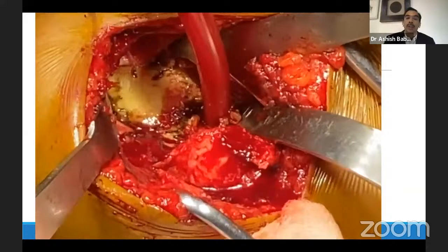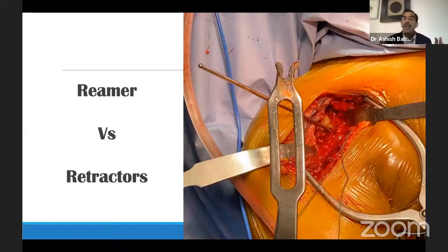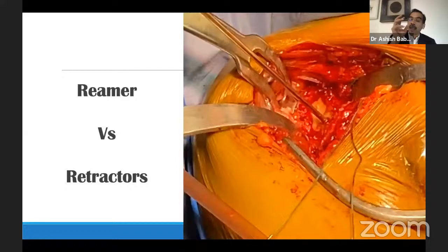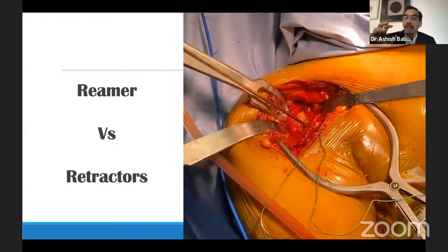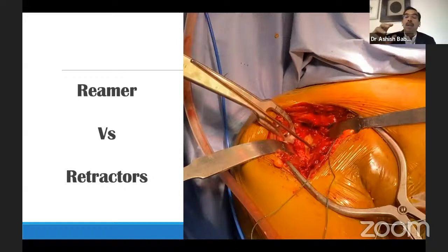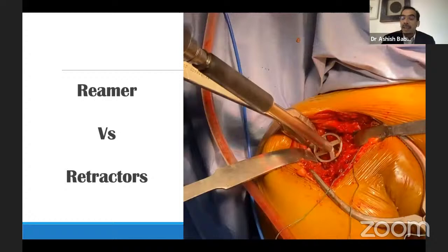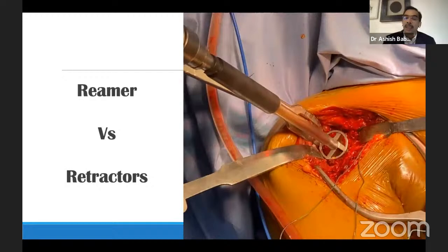Now you must understand that there's always a major conflict between the sharp powered reamer and the retractors here. So this is the Y retractor, sorry. Let me go back there. Okay. So this is the Y retractor that goes in gently underneath at 6 o'clock. Sometimes I add that on the posterior side as well because of the curvature, it allows the reamer to come in. It's not unusual to have the reamer conflict with the retractor. And in that case, it is dangerous because it can fracture the glenoid. One doesn't understand the power of these reamers. So sometimes you have to be very careful and ensure that it's freely rotating and it's not catching on any of the retractors. That can be dangerous because you're dealing with some very fragile bones, very osteoporotic ladies in these cases. So as long as you have free run, then you have to do only a gentle reaming.